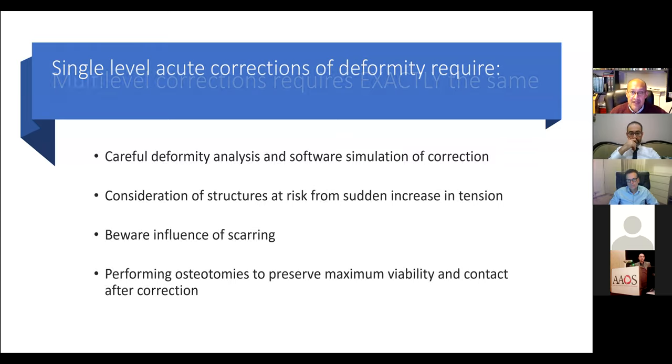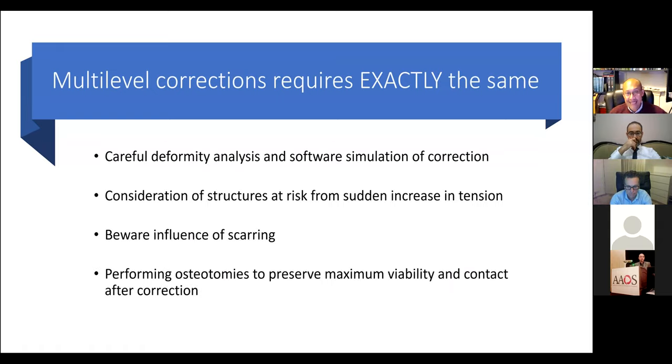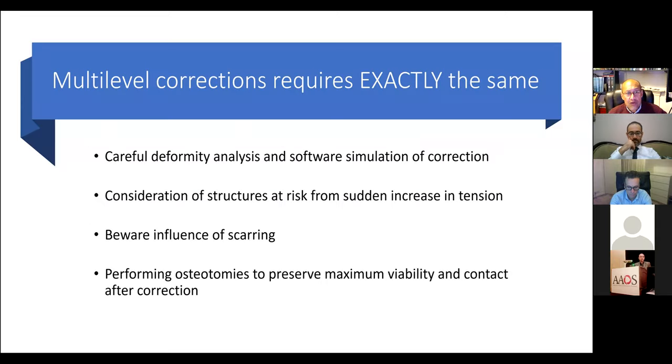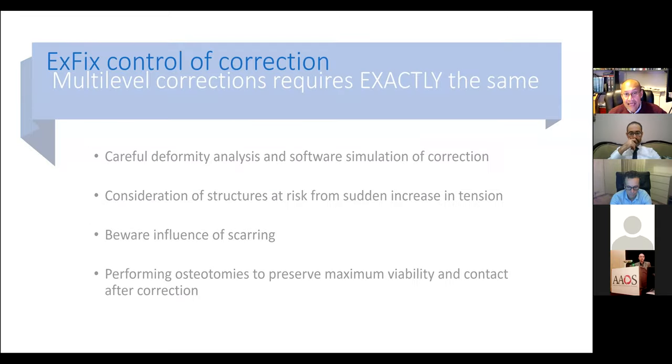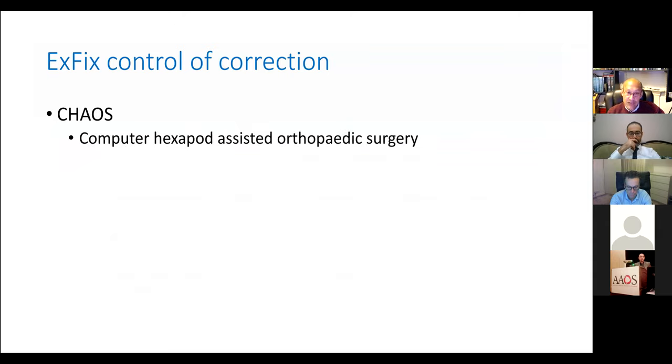In multi-level, it is exactly the same. All the same points apply at each level for multi-level as they do for single level acute corrections. Now, we've heard already that the X-fix control of correction can be done using a hexapod, and Professor Sharma introduced, or rather mentioned, the CHAOS technique, which is computer hexapod assisted orthopedic surgery.